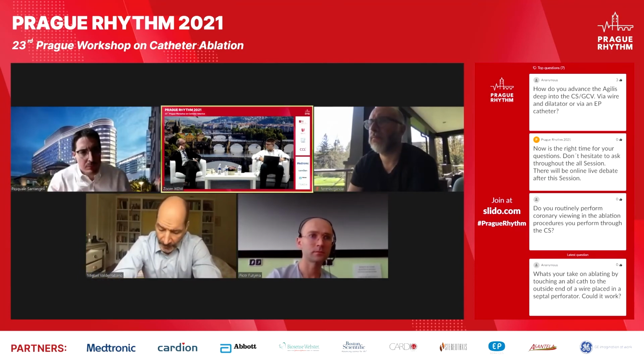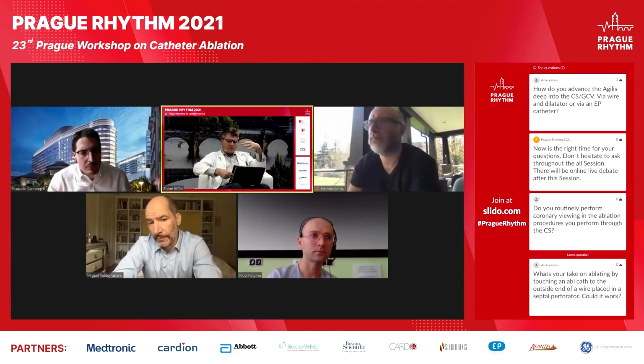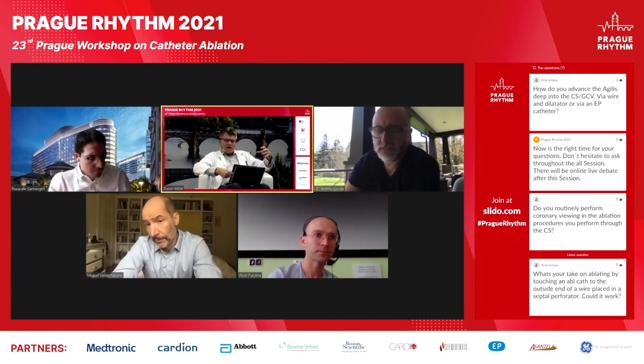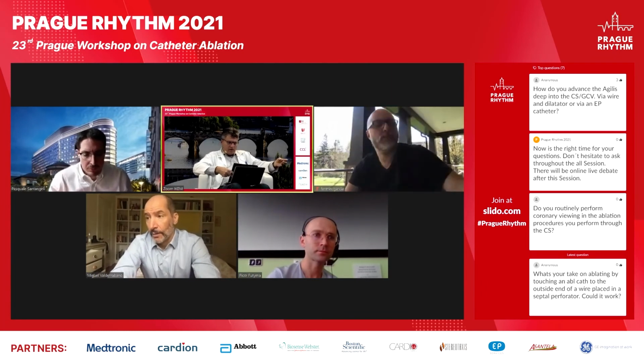Okay. And a question for Miguel. One more question to Miguel. What is your strategy for ablation at sites? Are there any configurations that are not suitable for alcohol ablation? I can imagine if you find the earliest activation at, let's say, branching of relatively large veins, if it is not deep inside myocardium, there is no option for double balloon technique or.